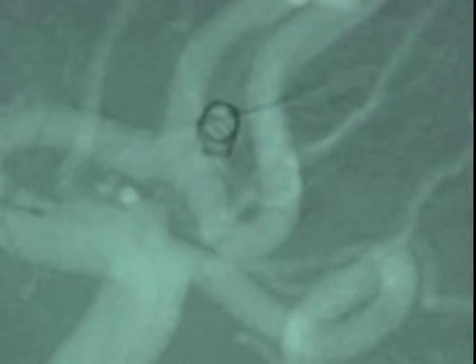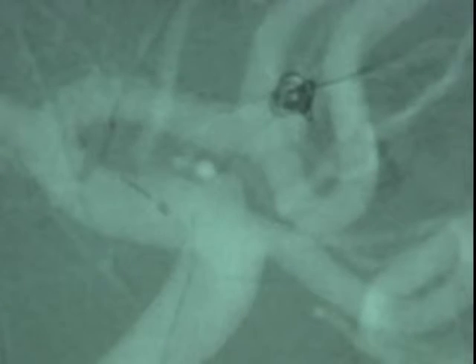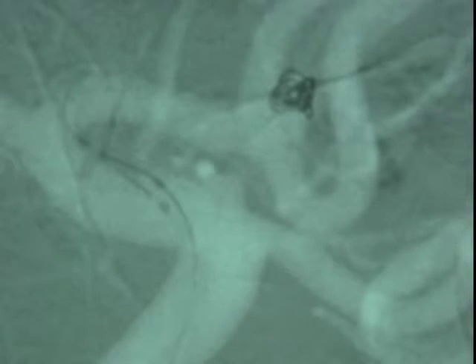Here the first coil is being advanced through the first catheter and it has been placed into the aneurysm. The coil has not been released. A second catheter is now advanced over a micro wire. This second catheter will also be placed within the aneurysm.